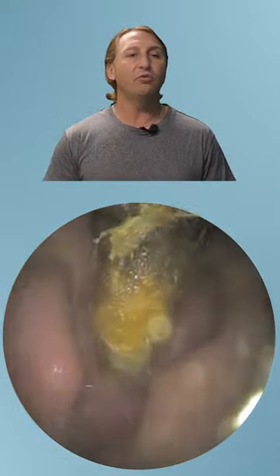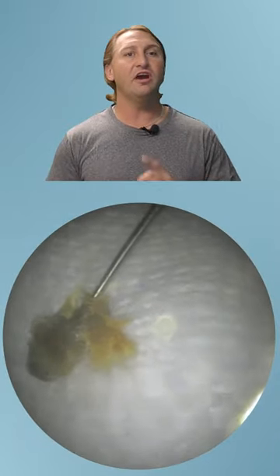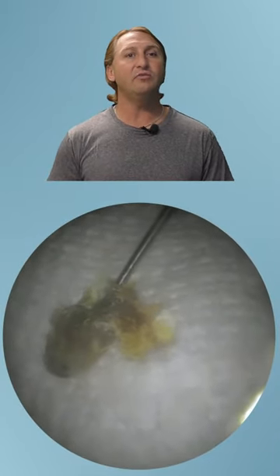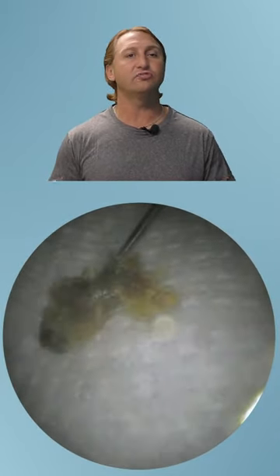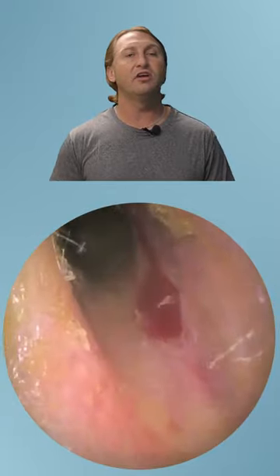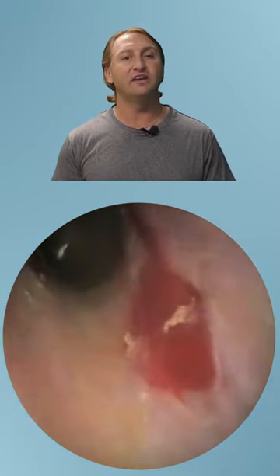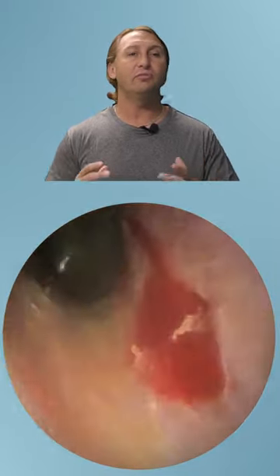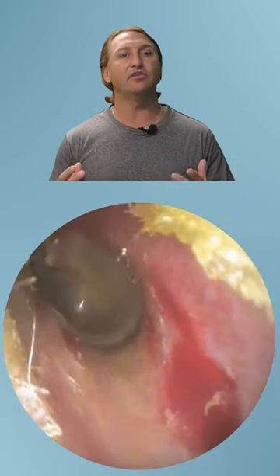The patient did not report any pain or discomfort. However, as we look back in, we can actually see that we did cause a small abrasion in the patient's ear. Now this is seriously magnified. So that may look huge, but again, your ear canal is actually very small.